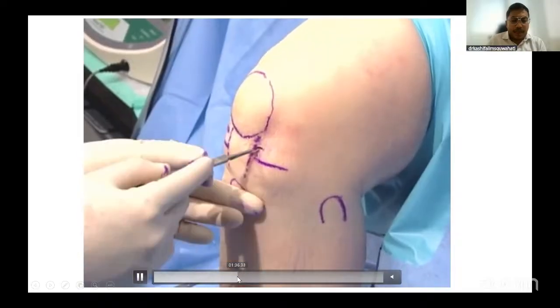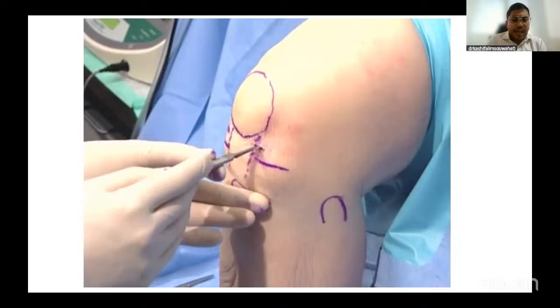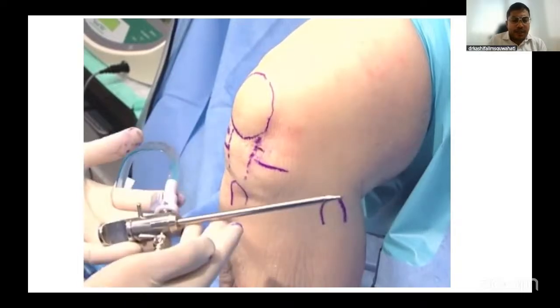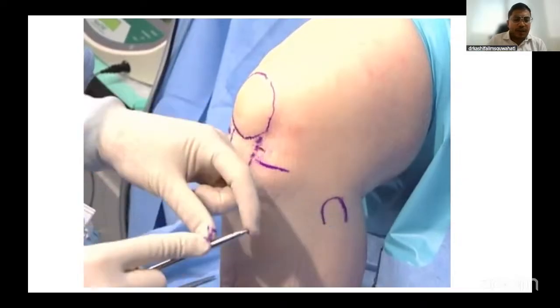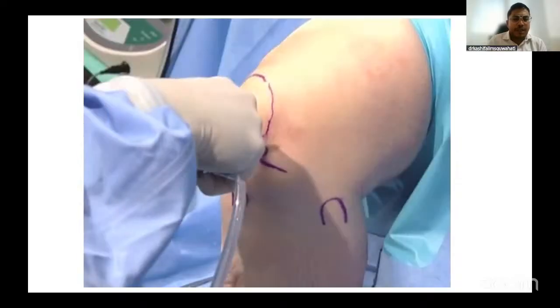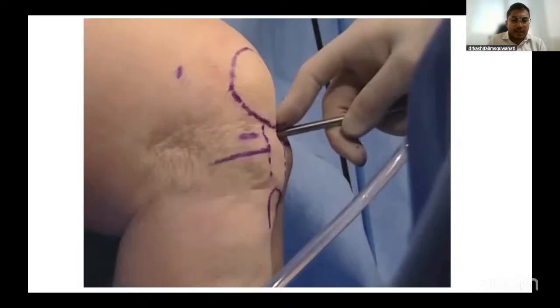And so here, as you can see, we make the horizontal incision first, with good control over the knife blade so that it doesn't slip away, and you have to make sure that you are above the meniscus, in that soft spot. Always keep the trocar under your control, with your index finger right over the trocar, so that you have control when you're pushing in and getting that give-way feeling, and you're not barging in and trying to fiddle with the cartilage.